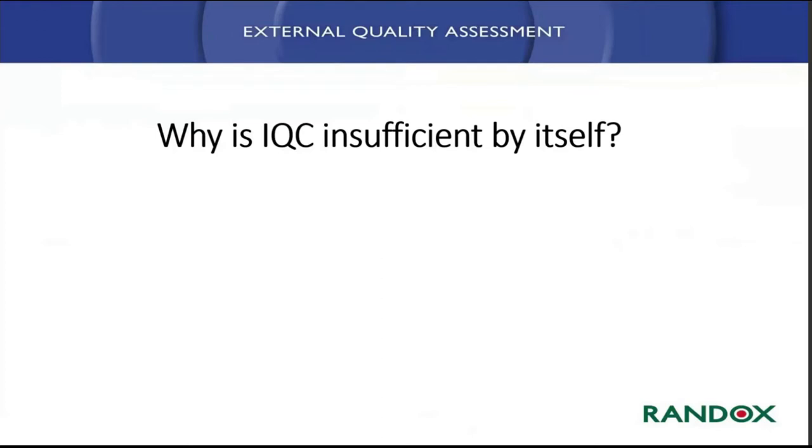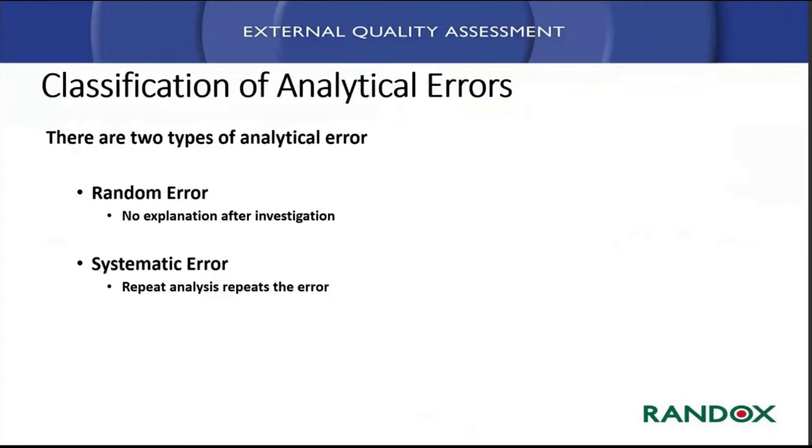So I'm going to introduce some features to you of external quality assessment, and why internal QC is insufficient. Although it provides useful information, or actually it's information that you cannot do without, it's not the end of the story. There's so much more than internals.